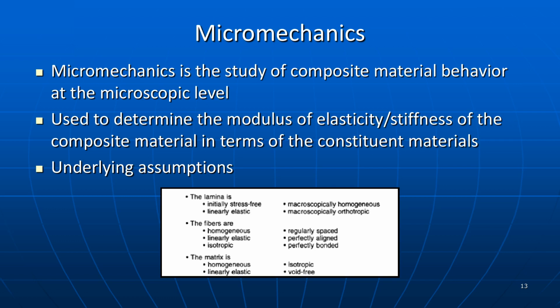In general, the matrix material and reinforcing fibers are modeled as being homogeneous, exhibiting linear elastic behavior, perfectly aligned and bonded, with no voids in the construction. All layers in the design are considered to be perfectly bonded to each other. If the actual constructed catheter design departs from any of these governing principles, the CathCAD modeling results will depart from measurements made on the actual parts constructed.